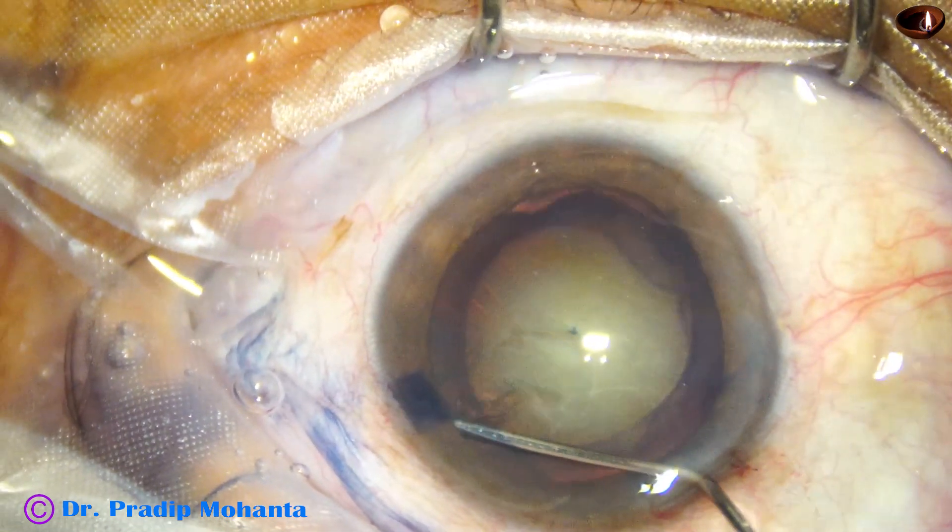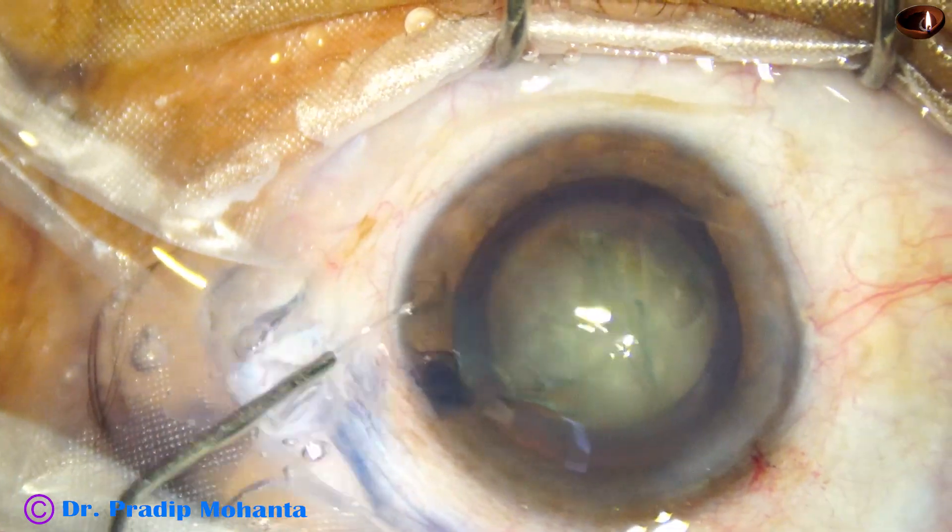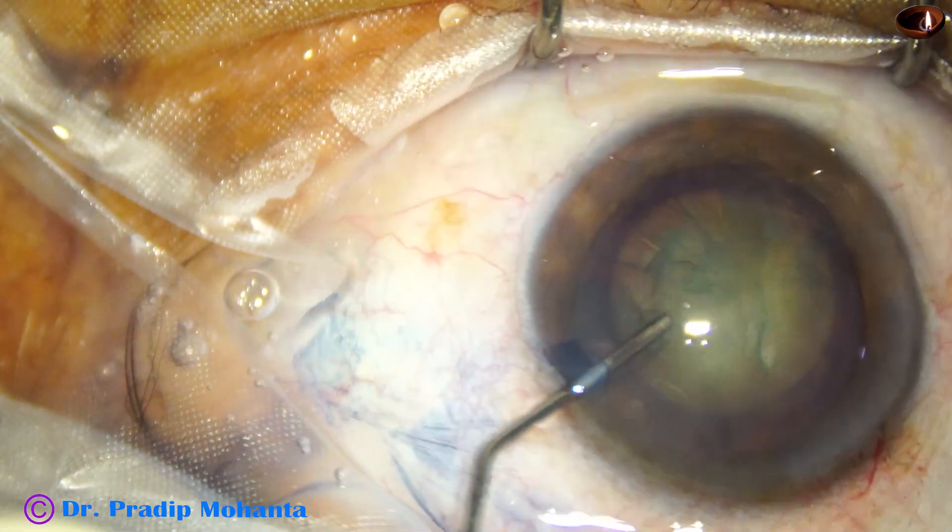Hydrodissection is done with BSS. The nucleus is tapped and then rotated.